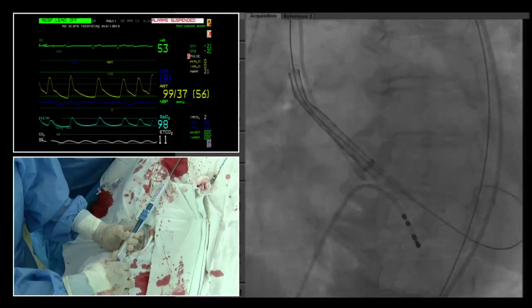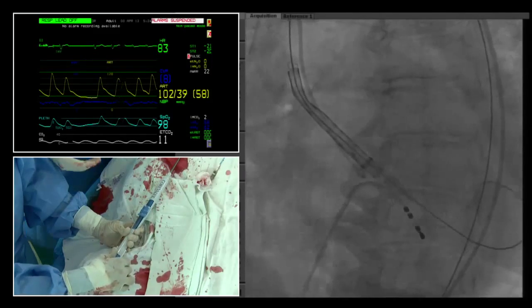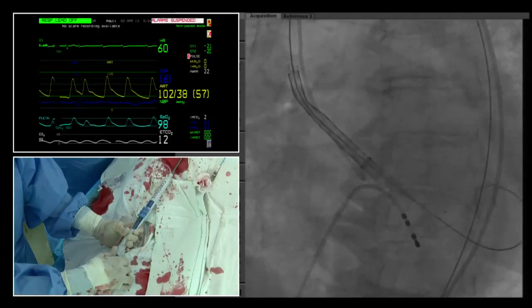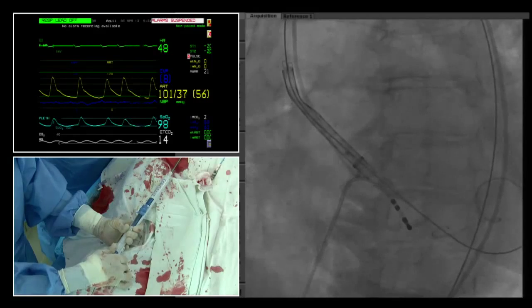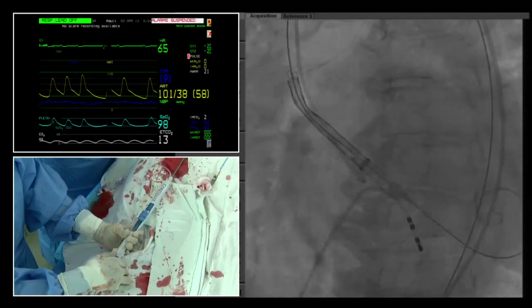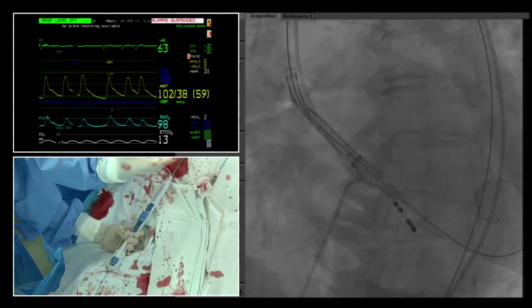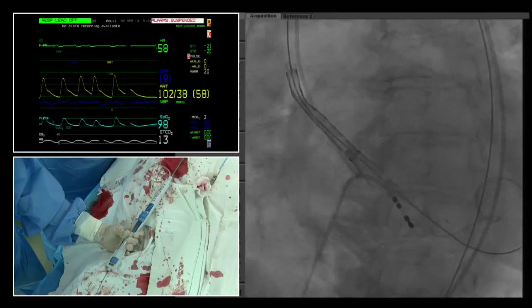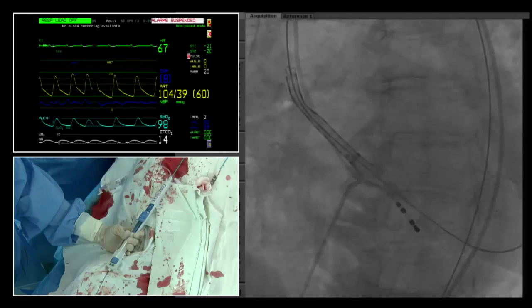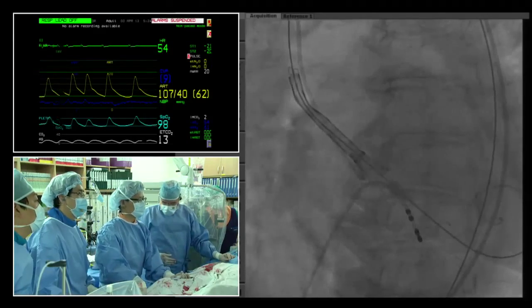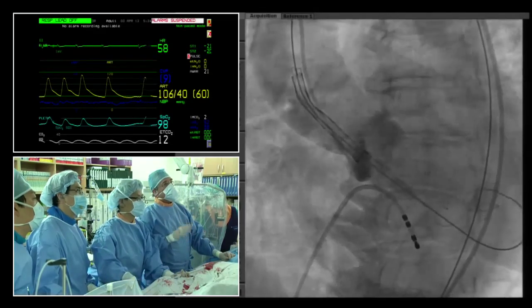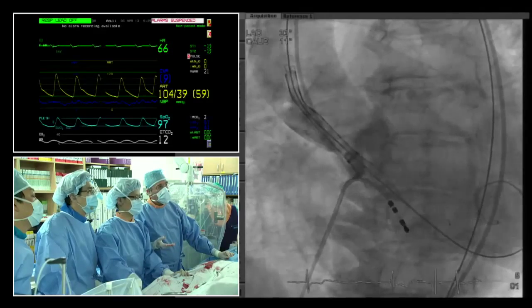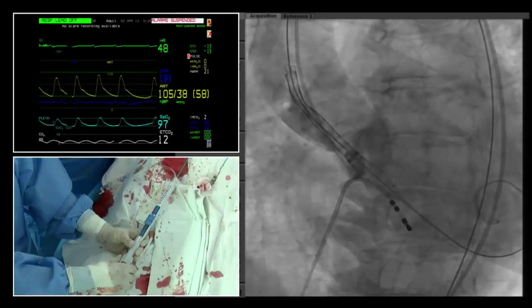Deployment continues slowly. The sheath comes back; the frame begins to expand. The outflow tract is not yet obstructed. Kim pauses and the frame continues to self-expand. An angiogram is performed to assess position — it appears satisfactory at approximately 4 mm implantation depth. The Y-wire position looks fine; some bradycardia is noted. Pacing at 65 is requested to provide more stability.